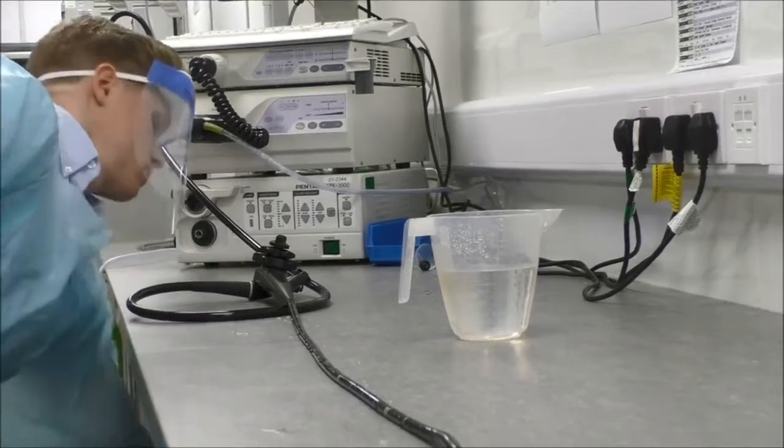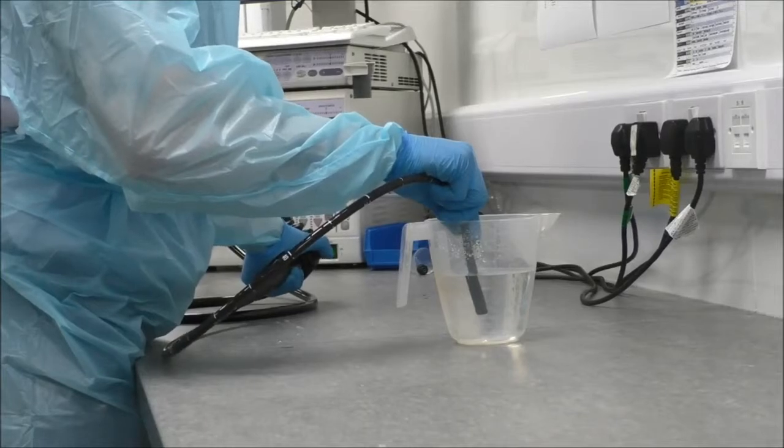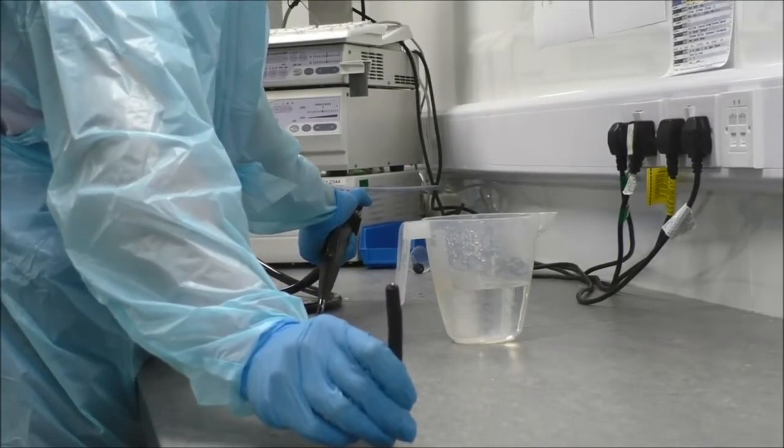Then, turn on the suction, press the suction adapter, and draw detergent solution through the channel for 30 seconds. Then, release the button and aspirate air through the channel for 10 seconds.